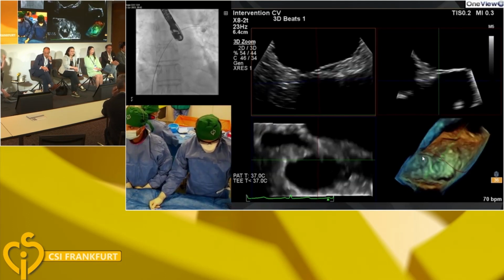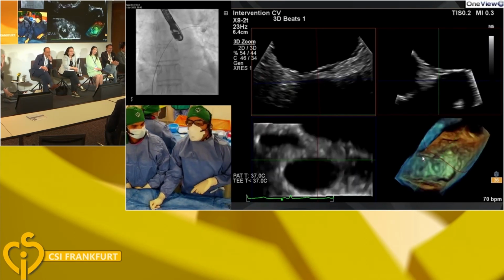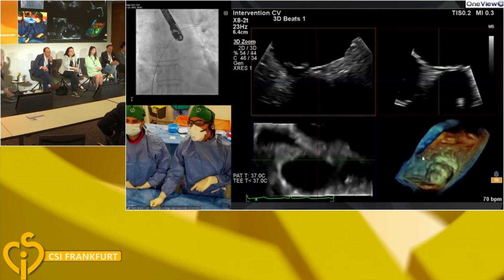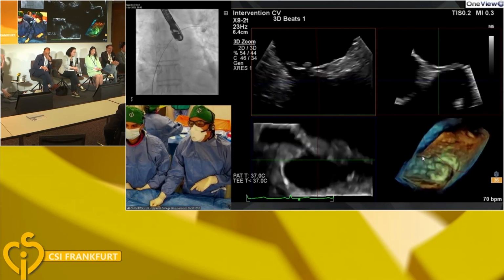Okay, Neil, are you planning to balloon size? There's one more comment. Very quick question for who one more image to show, which I think opt for not balloon sizing. Can you tell us very quickly what size of device would you put for who will not balloon size?